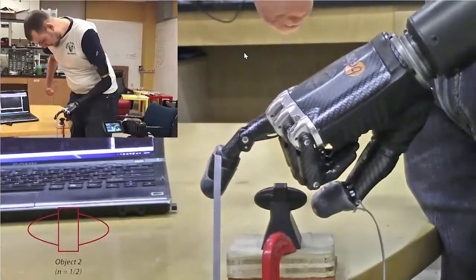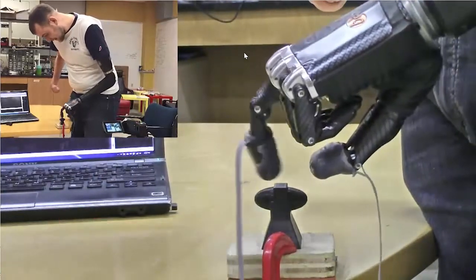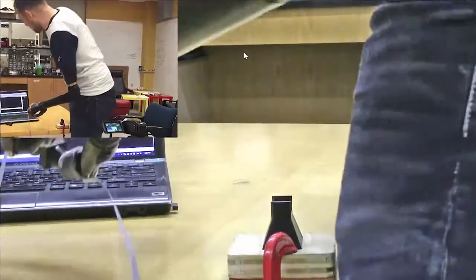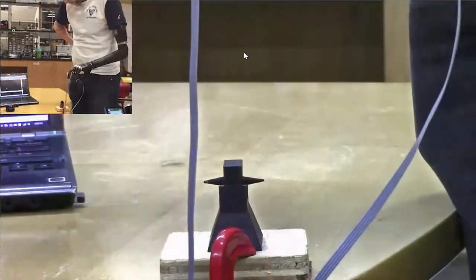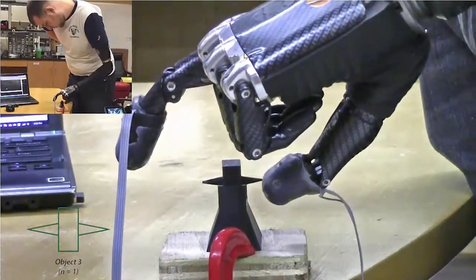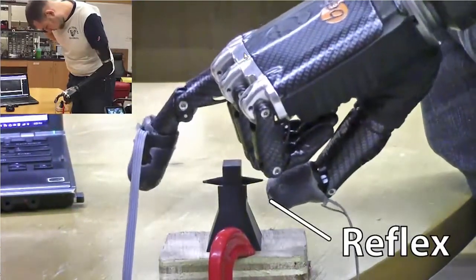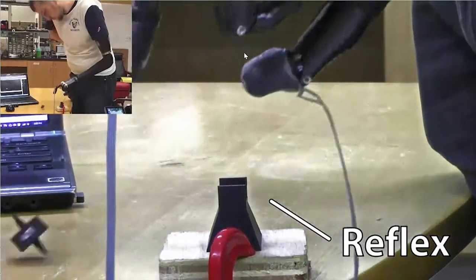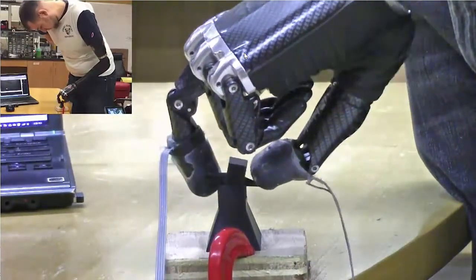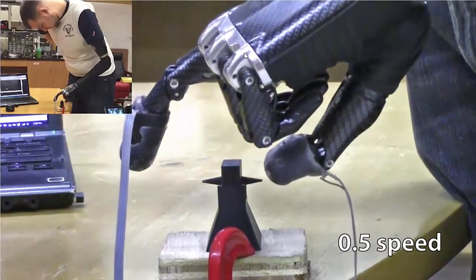By the way, each time he's getting some feedback, the stimulation feedback, so he feels that he's touching a soft or nice round object, and he is able to handle it. But now we're going to change that object to a sharp object. So when he touches that sharp object, he will get stimulus that is painful. And there is that reflex, because he himself will open up his hand like a reactive, so it drops the object.